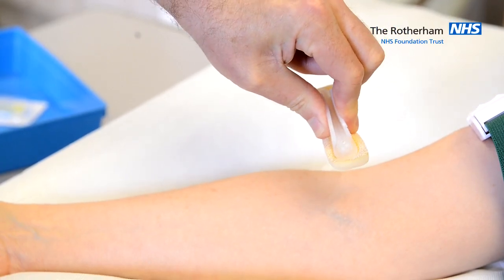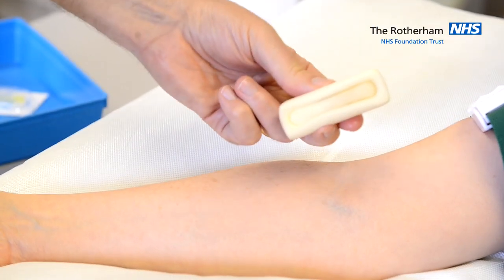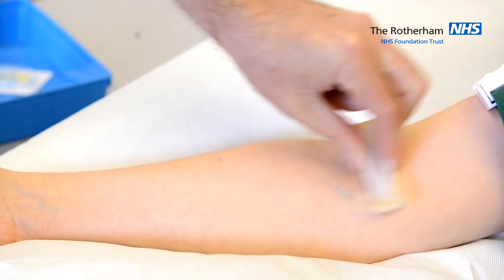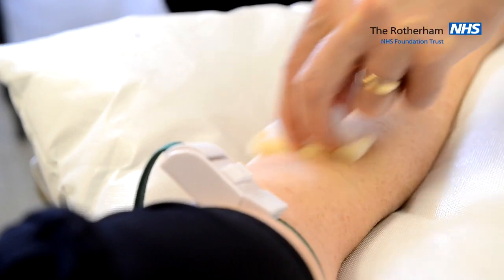To activate the sponge, we grip the wings together. That breaks an ampoule and soaks the sponge with the alcohol and chlorhexidine solution. Then we clean the skin for 30 seconds in multiple directions.